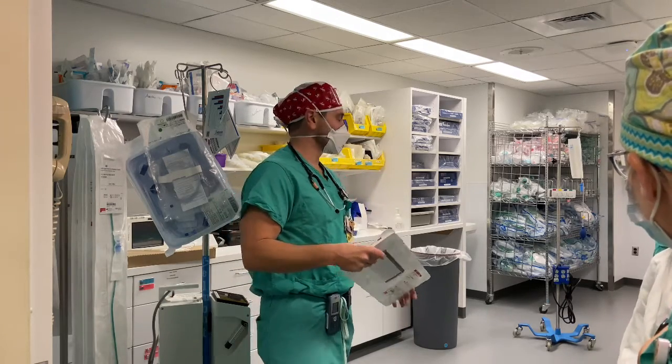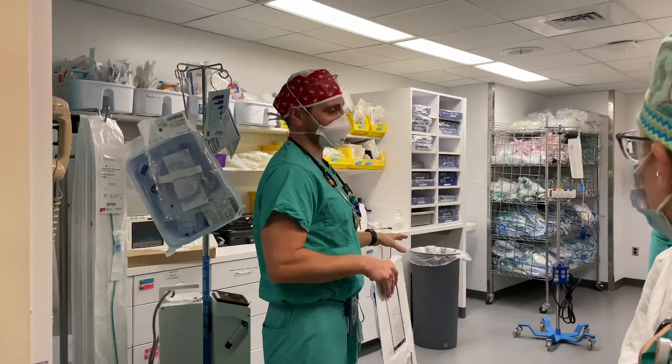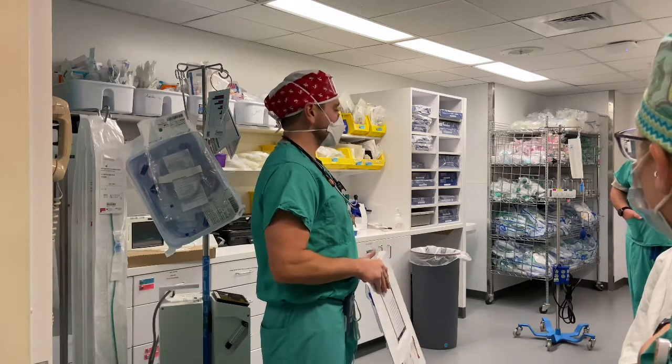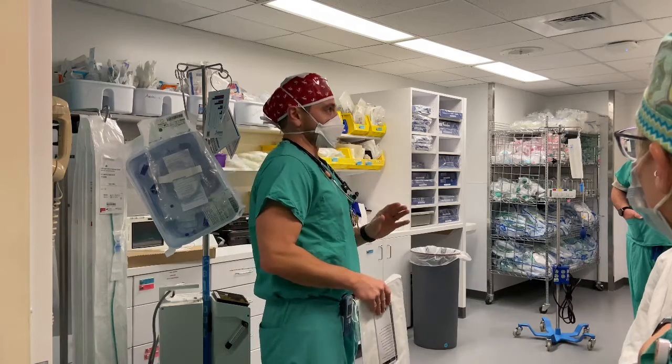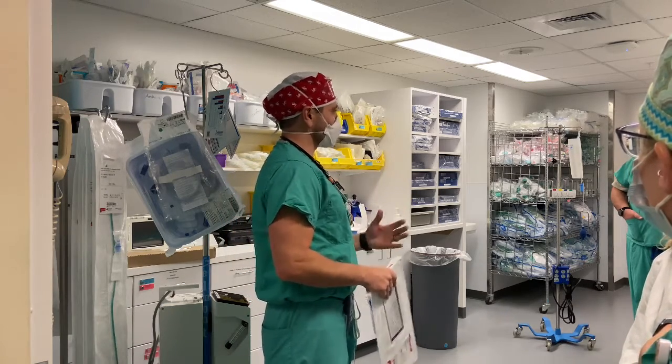Okay, so big picture stuff: intubate somebody when you need to use positive pressure ventilation. We talked about why you would use positive pressure ventilation. LMA is only used for your convenience. There's nothing about an LMA that's designed to be medically necessary. It's all about what's easiest.